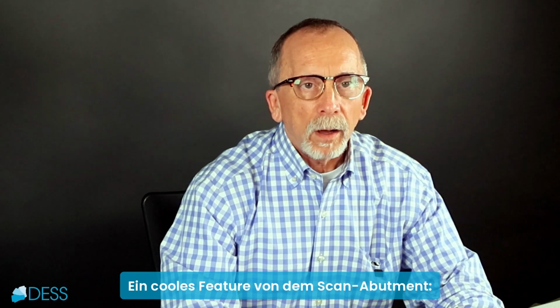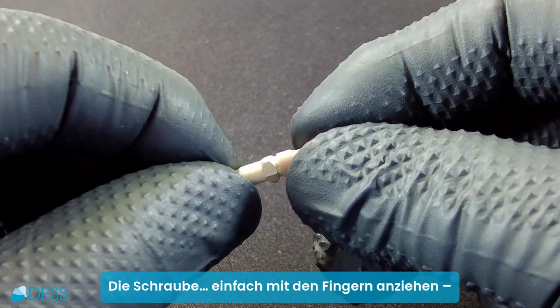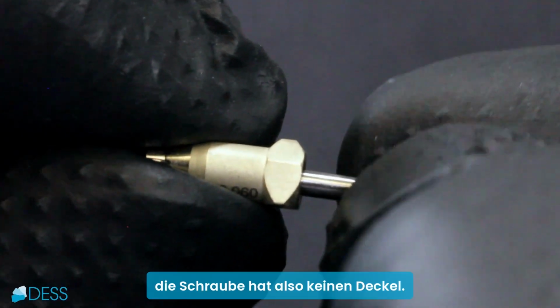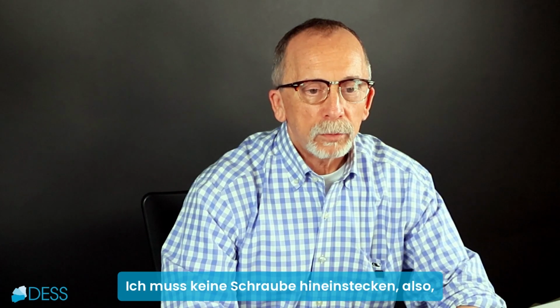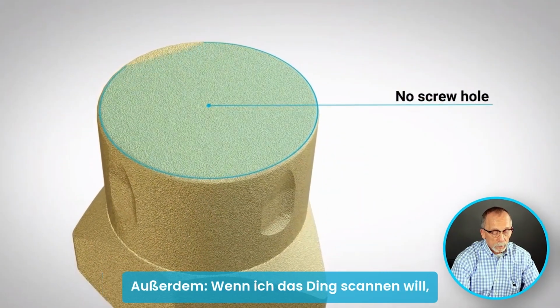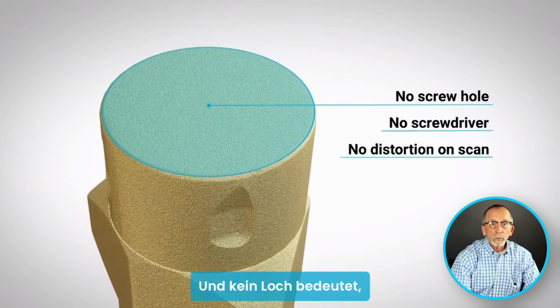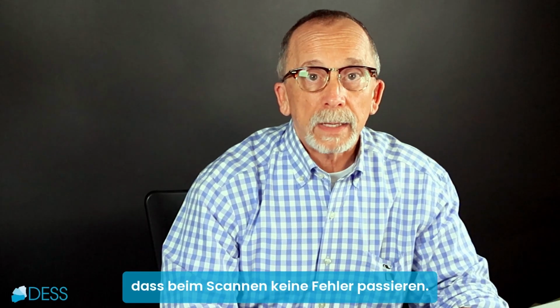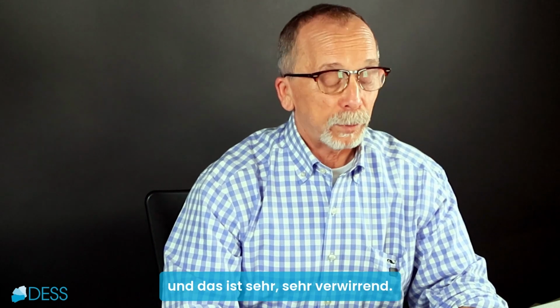A cool aspect of the scan post is that no tool is needed. The screw, we just finger tighten. There's no top in this thing, so I don't have to put a screw in it, which means that's easy. I don't need a tool. But secondly, when we go to scan this thing, there's no hole there. And if there's no hole there, that means I can't mess up the scan, because a lot of times a scanner will see a hole and get really, really confused.